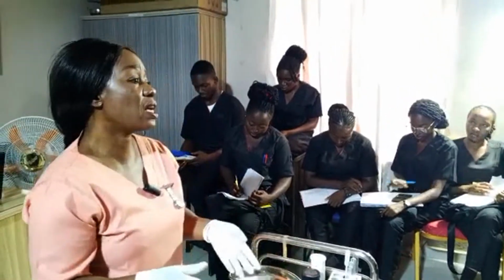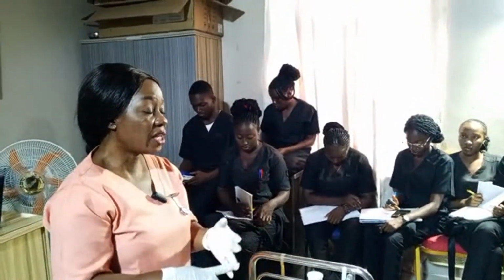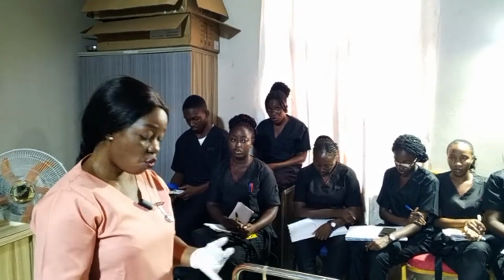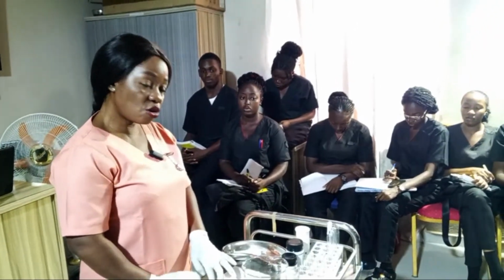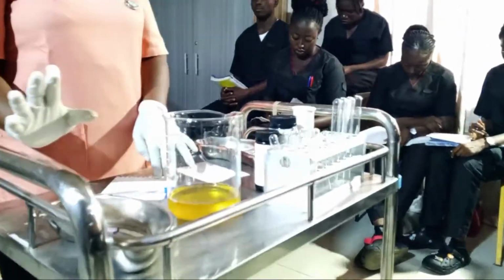So sometimes you can see, don't forget, you can see the particles. Some particles like the deposit, you can see pus, you can see blood. So you have to note all those things, right? You have to note it when you are doing deposits. The physical is the color. The color we say is amber, right? It's not just amber color. It's not too clear, right? It's just normal amber color.